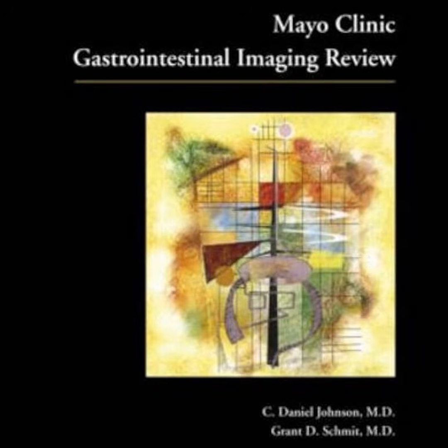Spot on. Okay, but earlier I was looking at a scan of a stomach with these massive swollen folds at the top up in the fundus. If geography is our main clue, what disease targets the top of the stomach but spares the bottom? That is the classic presentation of Menetrier disease. It drives massive hypertrophy of the mucosal folds, but it preferentially involves the proximal stomach, so the fundus and the body, while typically sparing the antrum entirely. It's just so elegant how these patterns emerge when you know what to look for.